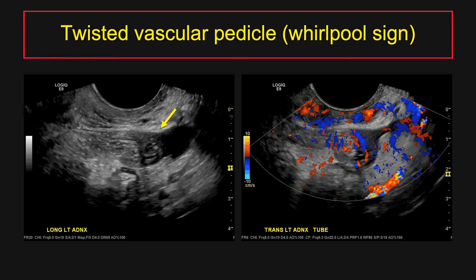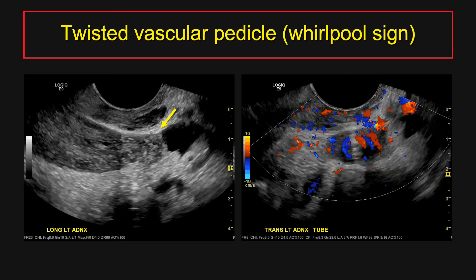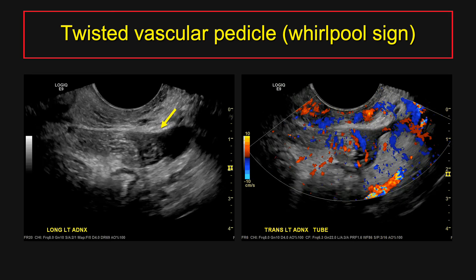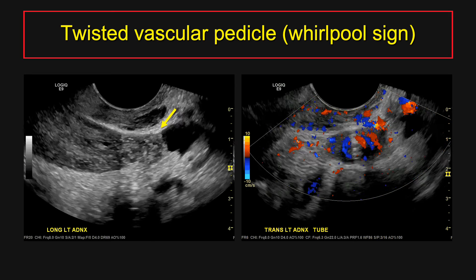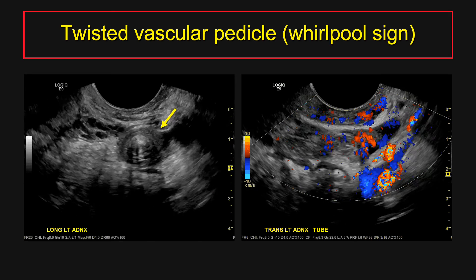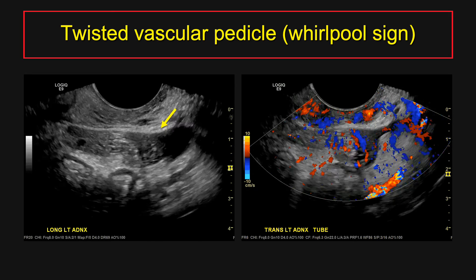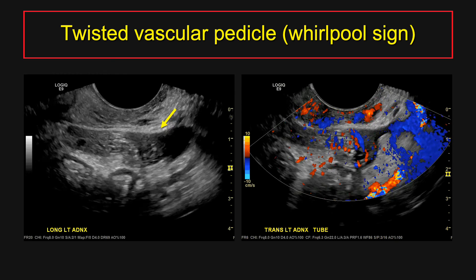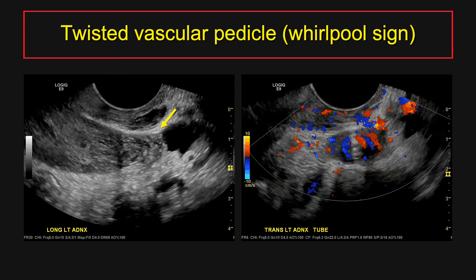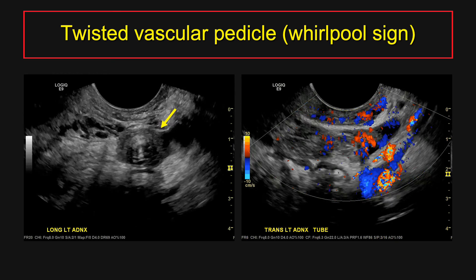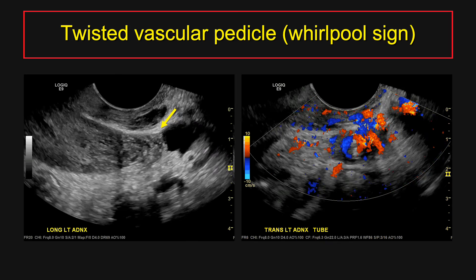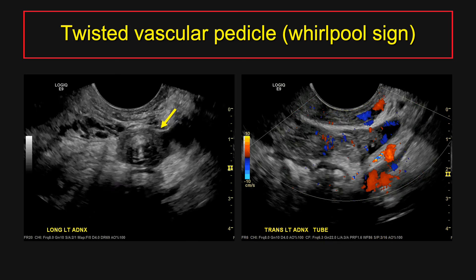Here's another case of the whirlpool sign in a 20-year-old woman with surgically proven ovarian torsion. On the grayscale cine image you can see twisting of the pedicle, and with color Doppler you can see the direction of flow around this pedicle.